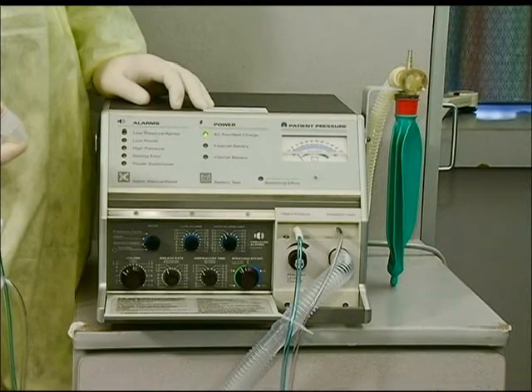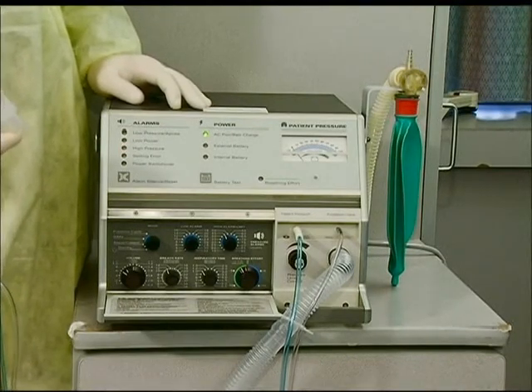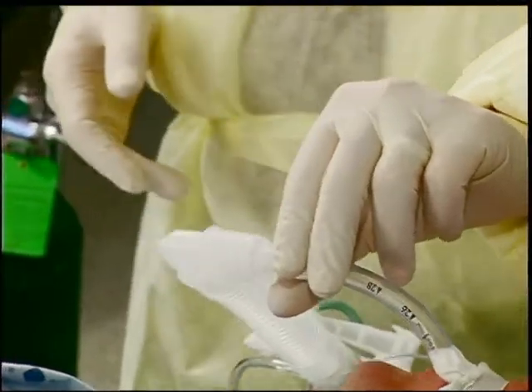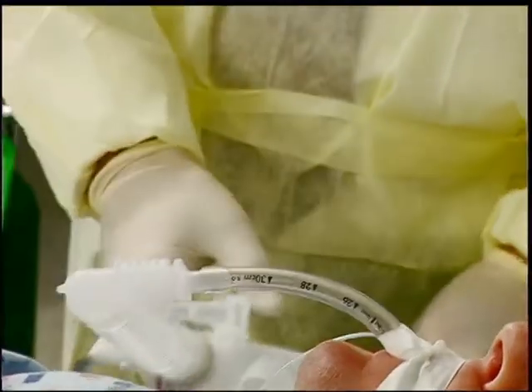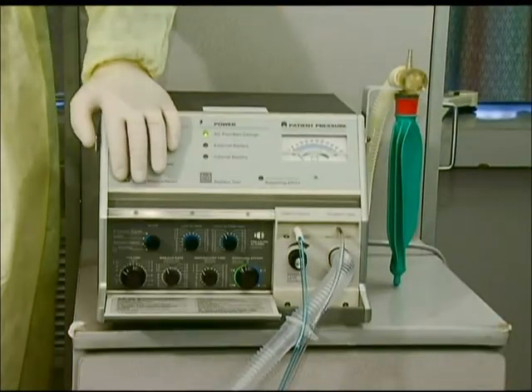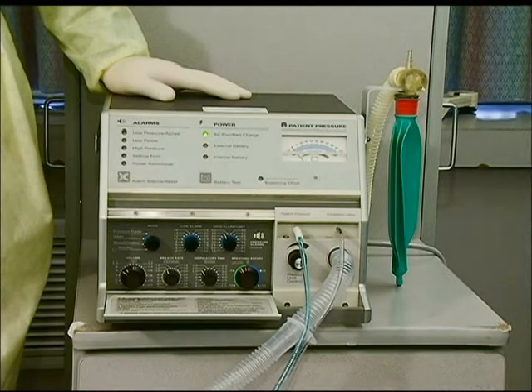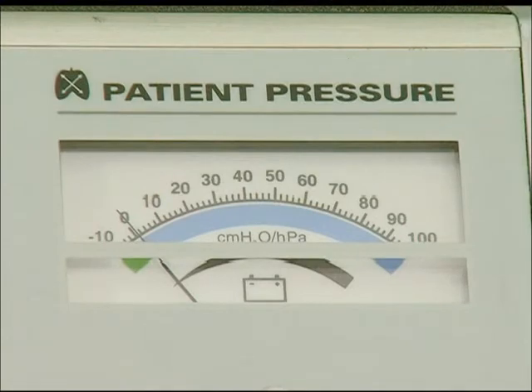Before connecting the ventilator circuit to the patient, verify that prescribed settings are set according to the prescribed orders. Connect the end of the ventilator circuit directly to the patient's endotracheal or tracheostomy tube. You should visualize the patient's chest rising and falling with each breath of the mechanical ventilator. Reset the alarm on the control panel by once again depressing the alarm button. If functioning appropriately, alarms should cease and no red lights will be illuminated on the alarm screen.